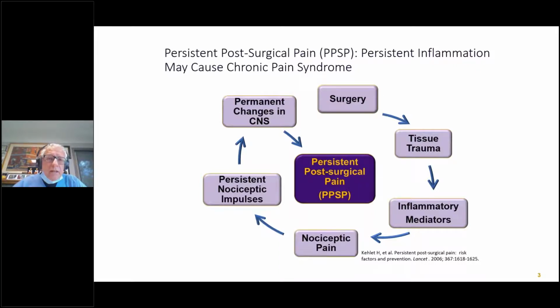In an acute setting, hospital, healthcare system, the Provant can be used to prevent pain chronification or chronic pain syndrome, and this has become very important. So early pain management is critical to really mitigate the chronification process. Persistent pain, as we know, can lead to both peripheral and central nerve sensitization due to the neuroplastic changes in the CNS. So if we can avoid these, bonus, that's going to be one of our goals as clinicians.